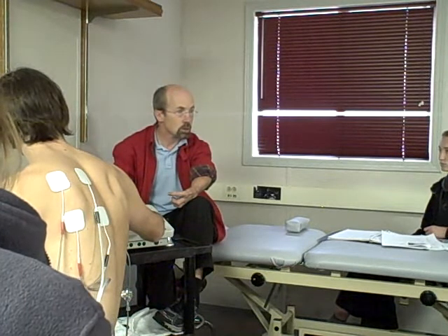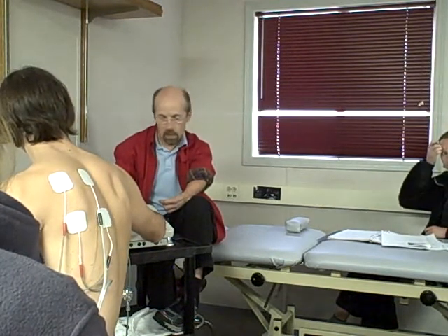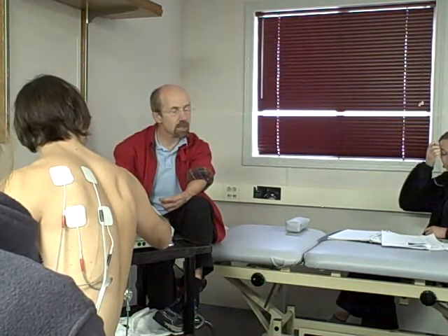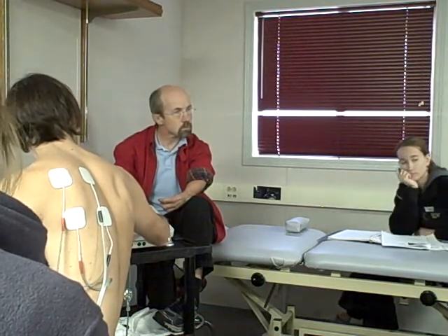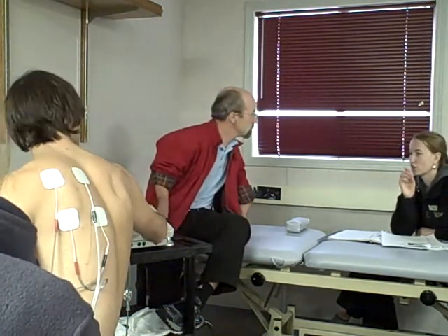So can you feel it? It's about sensation. I'm letting him do this right now, letting him decide. So now you turn it up until it feels right, and I just hit accept. Accept again. It took me a while to figure out how to turn those up, because once you hit accept, you can go like this, letting him choose where the current goes.